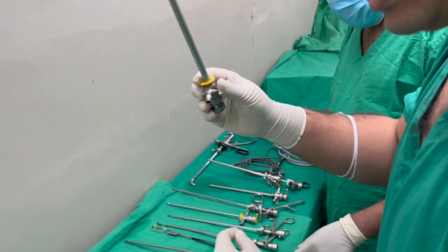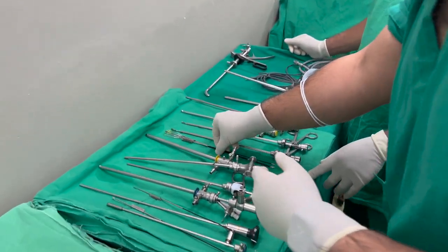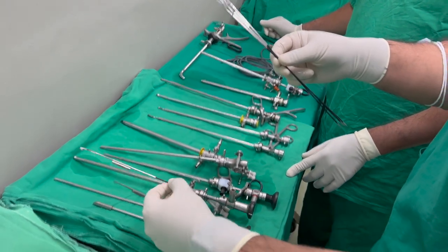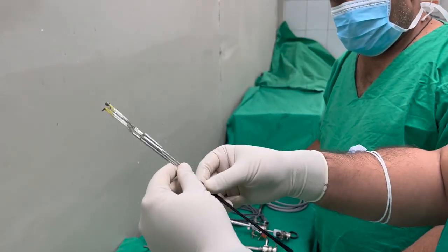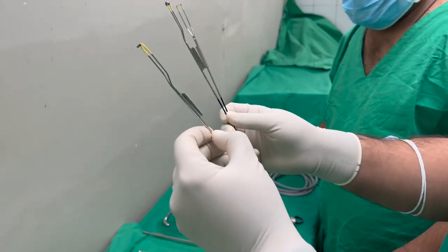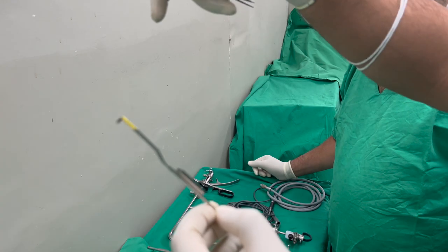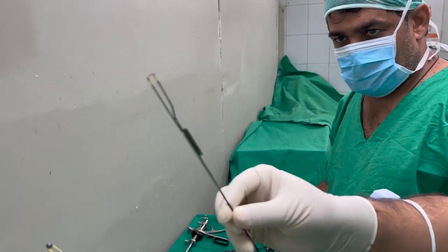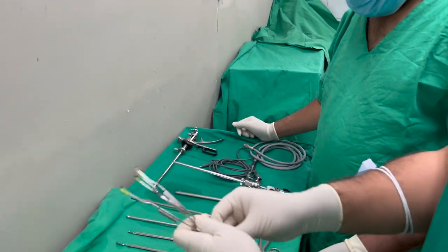We will be assembling this and showing you. These are other instruments — like we saw cold knives, these are the hot knives used with electrocautery. And this is a Collins knife — it looks like this, straight down. This is a rollerball for coagulation. And these are the resectoscope elements.